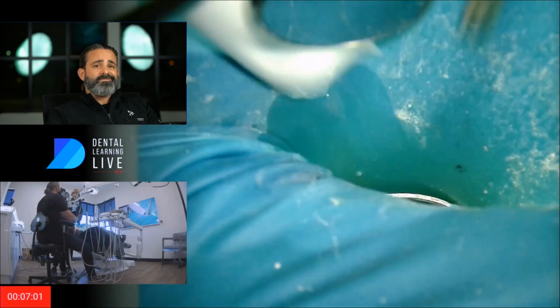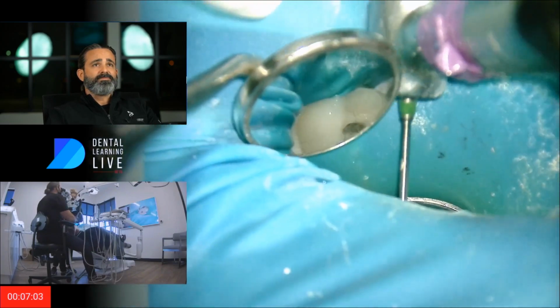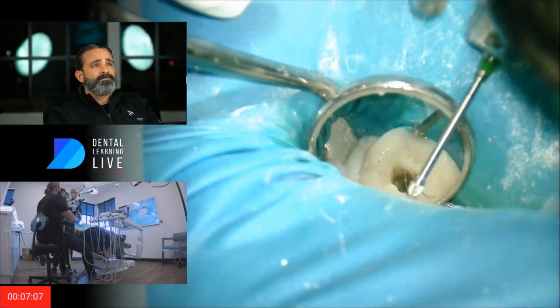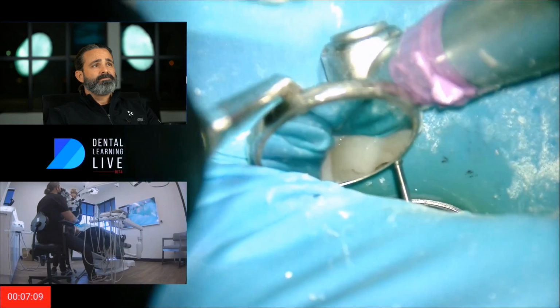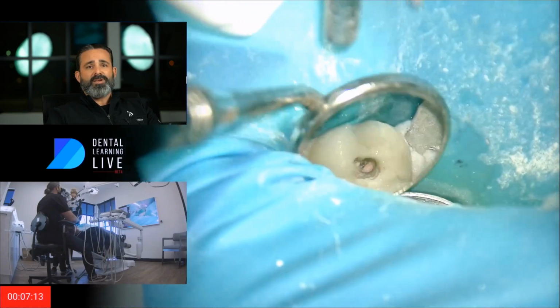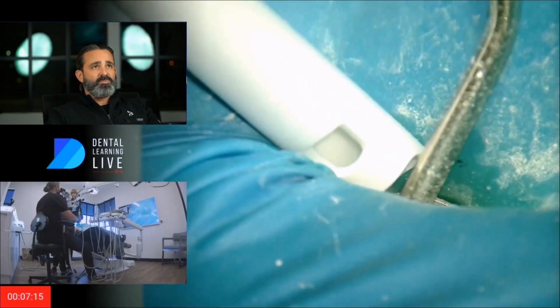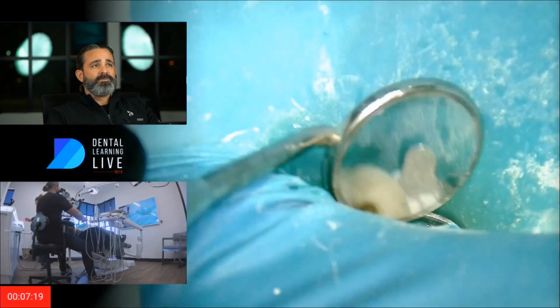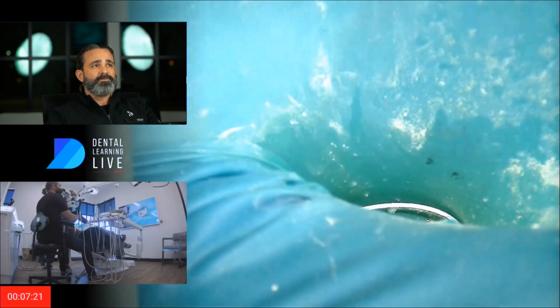And we're just going to find the anatomy. Kind of boring for all you experts out there. Quickly I found the distal buccal. Now I'm actually kind of going down and just exposed the palatal. Right there.